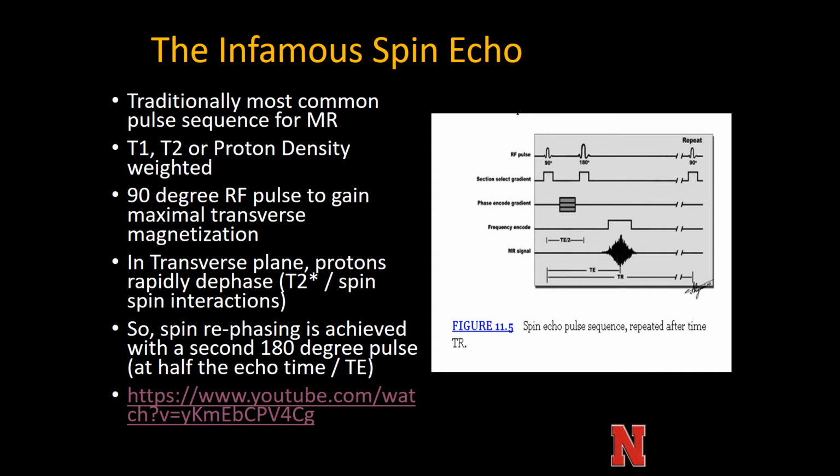That was very important in the early days of MRI technology because things just couldn't run fast enough. With improvements in technology, a lot of these sequences are now obtained according to a fast spin echo technique, which does things differently. We'll get into that later on. But early on, especially, all of the pulse sequences were really a variation of a spin echo.